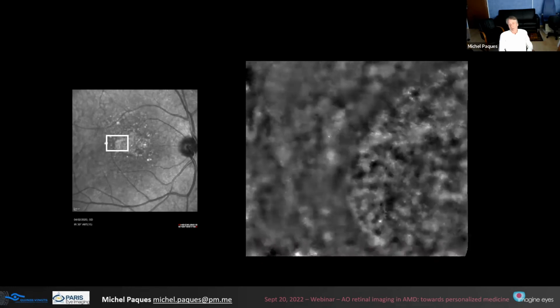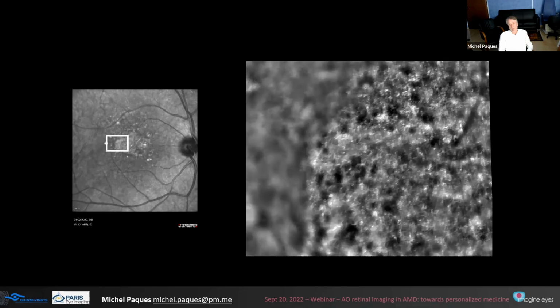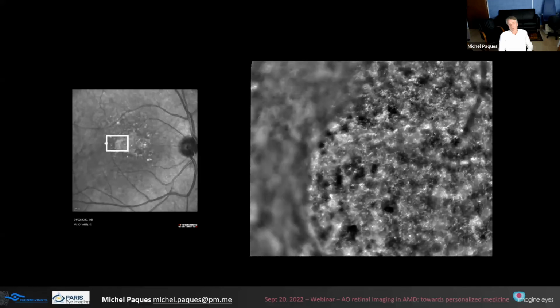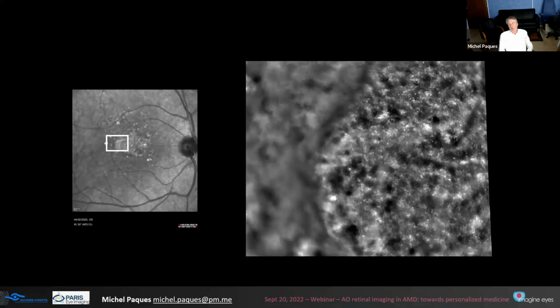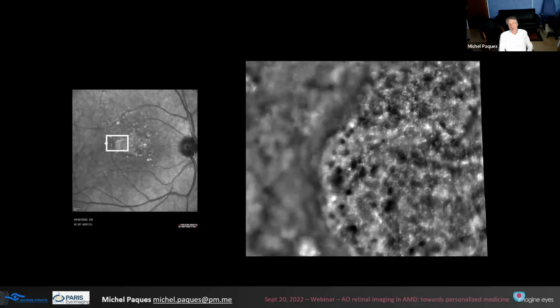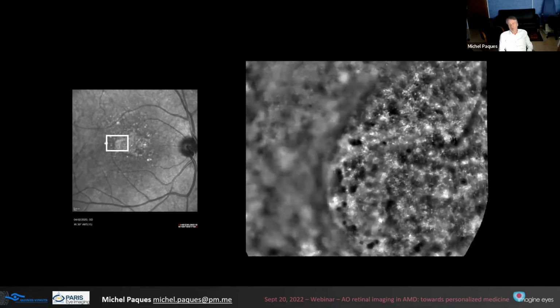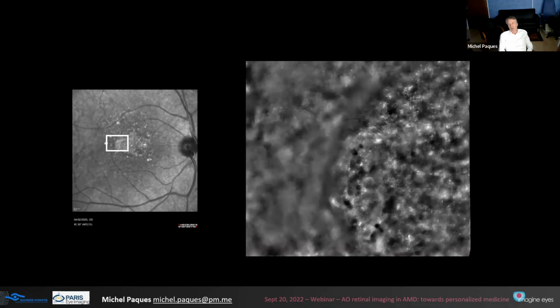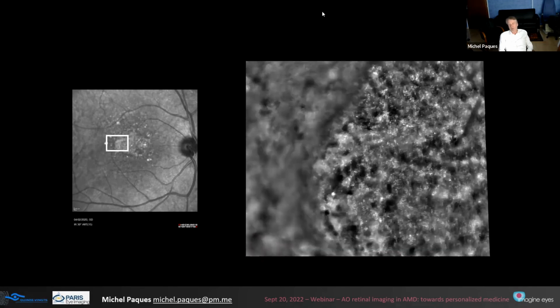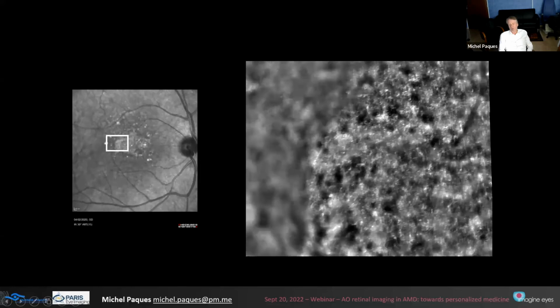And this was the first demonstration that AO can very precisely measure the progression of AMD over weeks, and let's say reasonably within months and sometimes within weeks, which, addressing the issue of the duration of clinical trials mentioned by Andrew, is indeed maybe a game changer in order to appreciate more rapidly the effect or not of a given drug. But also we were interested in what happens to the other structures, such as the pigment, for instance. And the big surprise was that there is also motion of these pigments, these dark spots that you see all over the place.